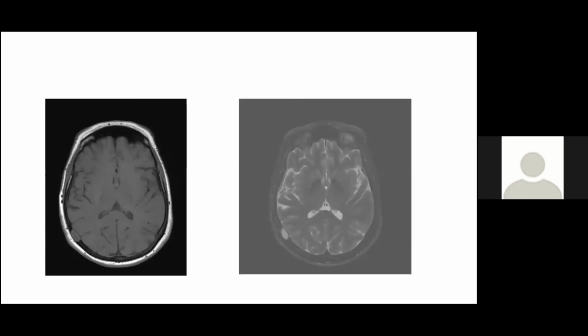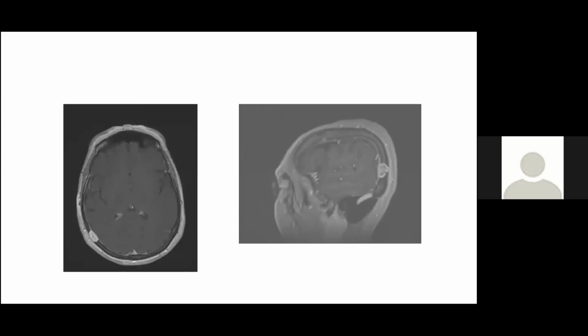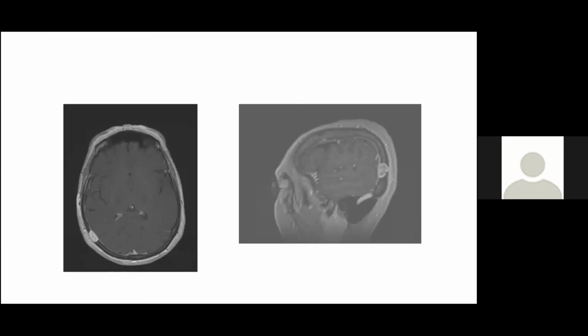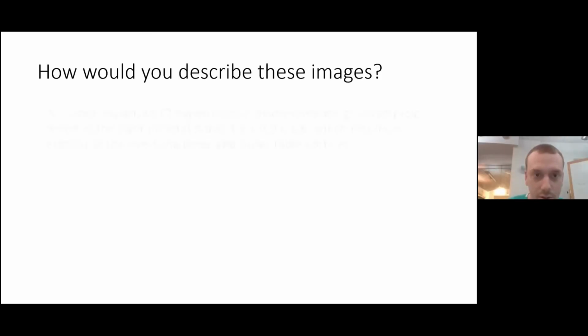So it looks like, at least on MRI scan, she's got an intradural, or maybe a dural-based lesion that is contrast enhancing underneath the calvarium, extraaxial. You can see some mild hyperostosis of the overlying bone. Okay. Yeah. Okay, very good.